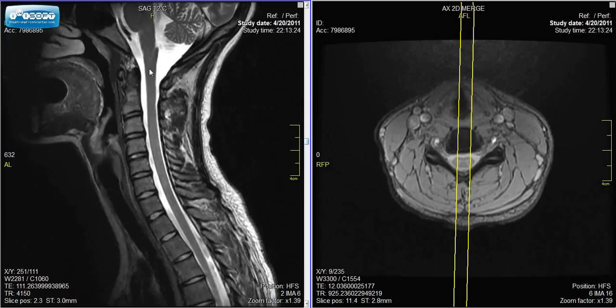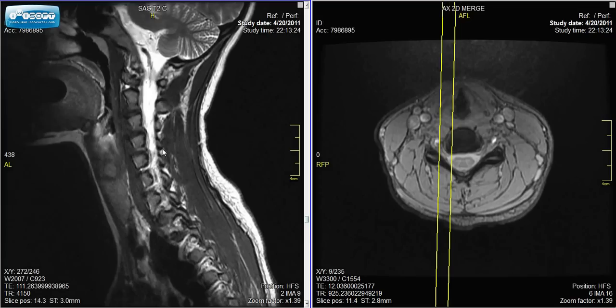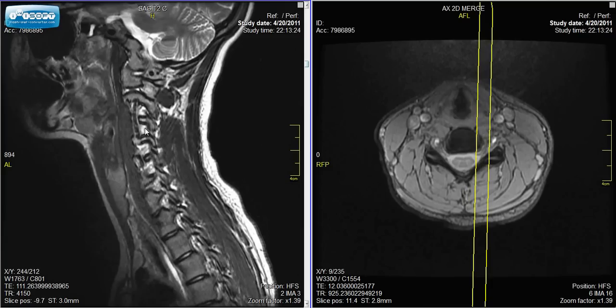On these views, the white surrounding the nerves is spinal fluid — CSF, cerebrospinal fluid.